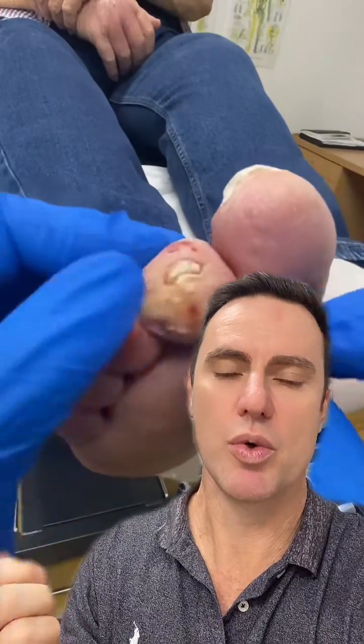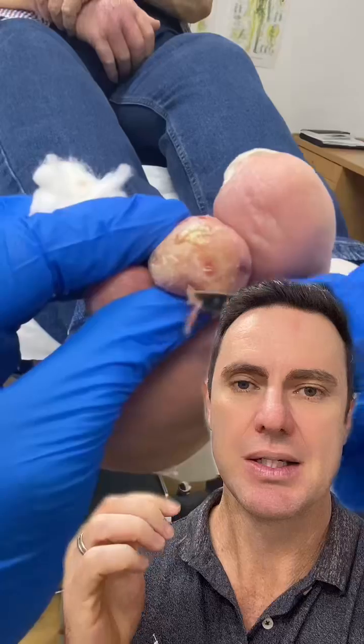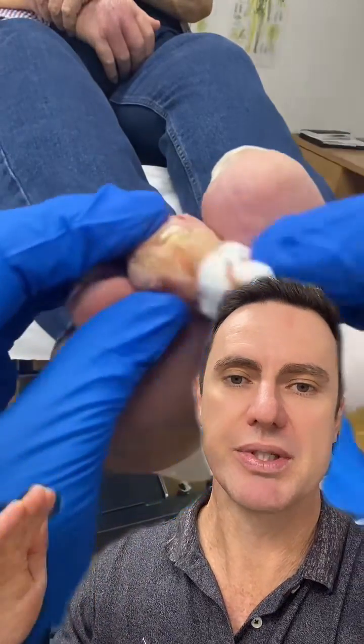So we need to remove the corn but then we need to remove all the non-viable or dead tissue around here, which you can see me doing now, down to the level of viable tissue so it will start to heal again. We do this usually down to just a little bit of blood.